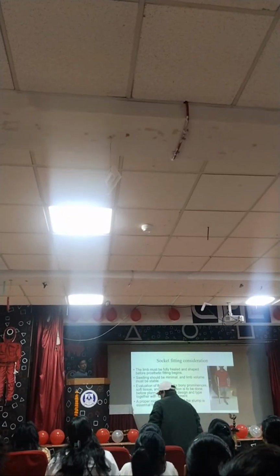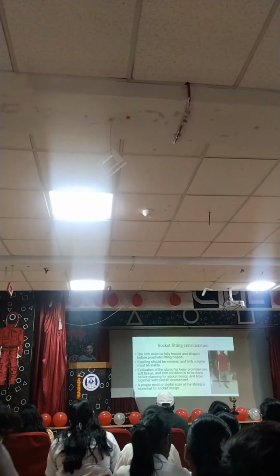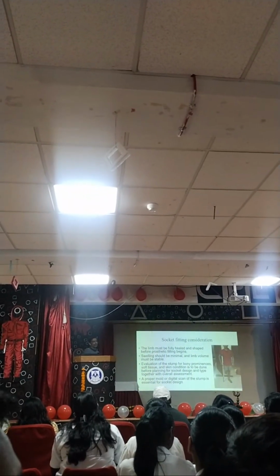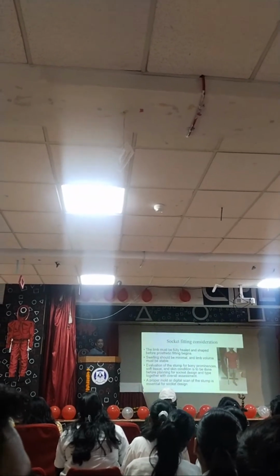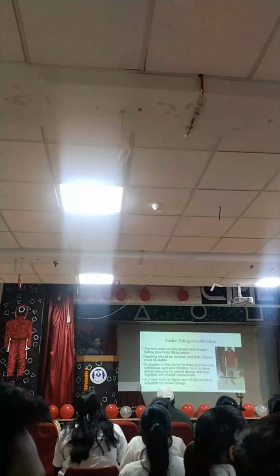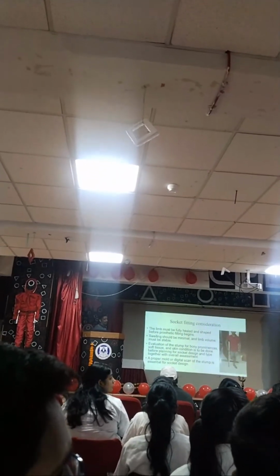Okay, so we have to understand all these factors, so we must assess in detail. Detailed assessment is very important. And I must say that the patient's overall assessment is more important than just the stump evaluation. So stump evaluation is important, but overall assessment of the patient is most important.